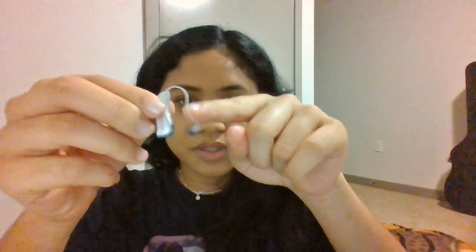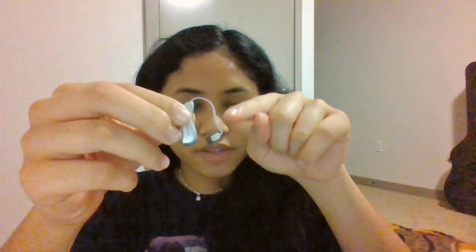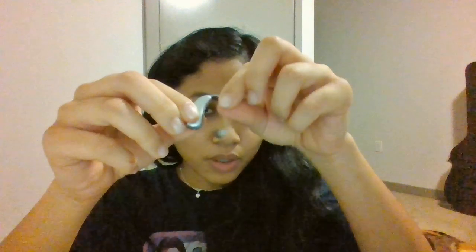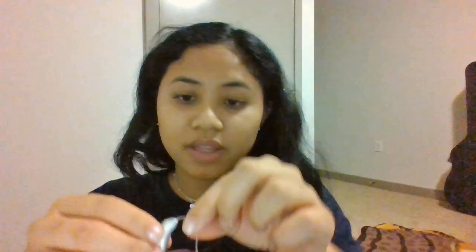As we go further down the hearing aid, you've got a slim tube. This is where the sound is traveling — after it gets picked up from the microphone, the sound travels through the slim tube and goes into your ear. This might also get earwax and debris, so the slim tube may need changing every now and then.